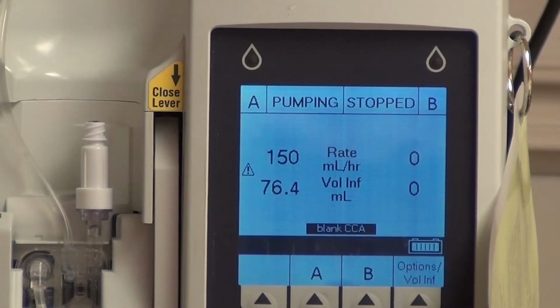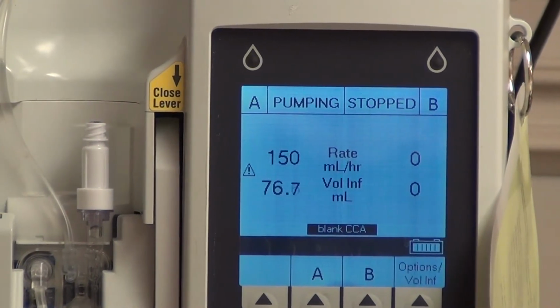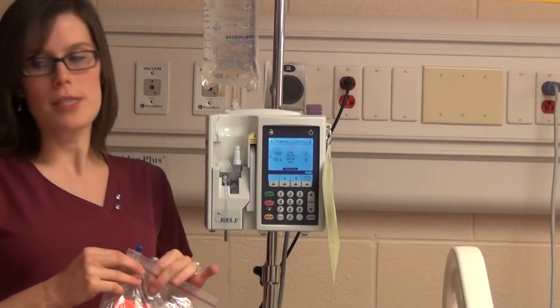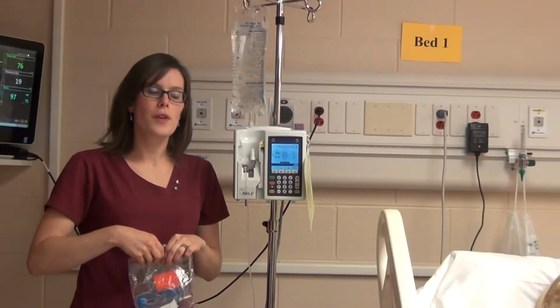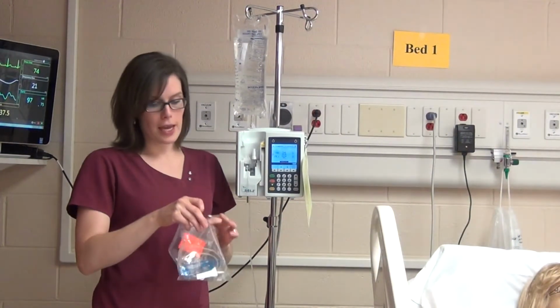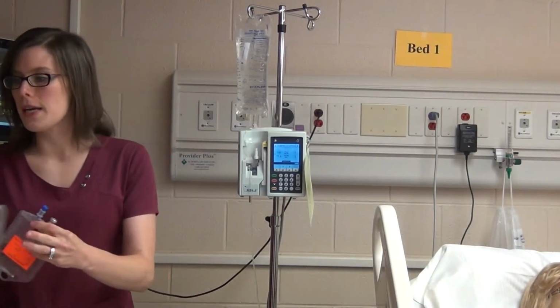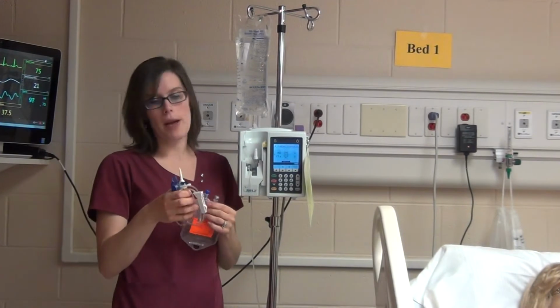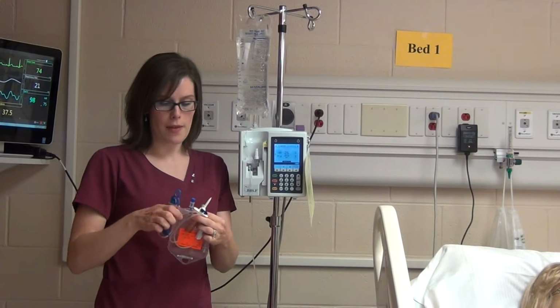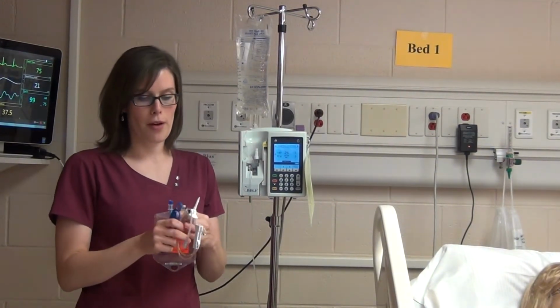Now, let's say that your patient had a medication that was due, an antibiotic, and that's via piggyback. So we have an example here. And we'll say that you've already scanned everything into the computer and done your 6 rights with your patient, and you're ready to hang everything. So we have a secondary tubing set here. We reuse things in the lab, so it might not have the covers on them, but in real life you would of course be using something brand new every time.